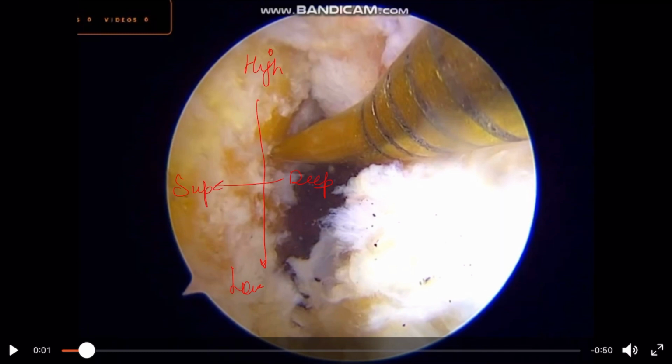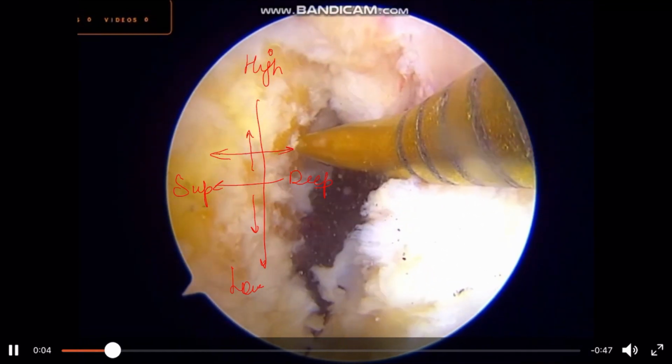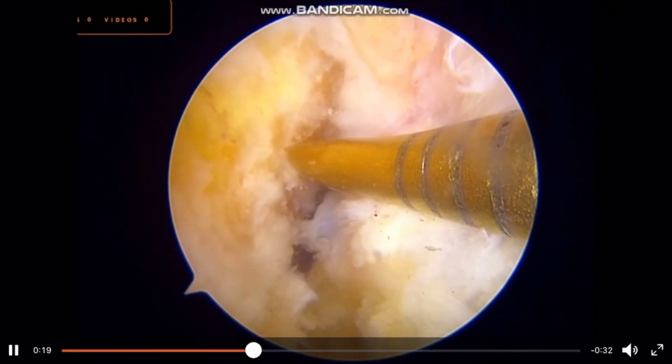The previous concept of 9 o'clock, 10 o'clock, 11 o'clock is gone nowadays. Now we see that our entry point should not be too high and it also should not be too low. So right about here, in this line, we make our entry point. As you can see here, I am using the chondropick to evaluate my exact point. Now I have marked my point here, and now I am hammering. Now I have made one mark.